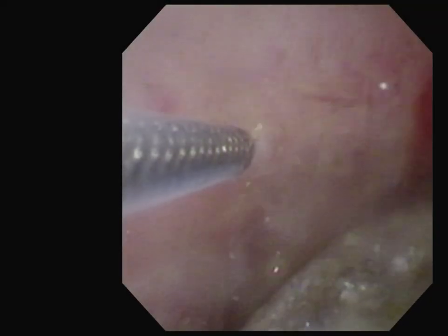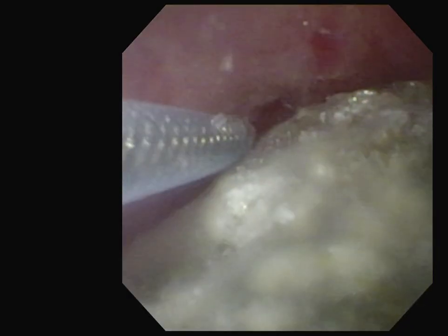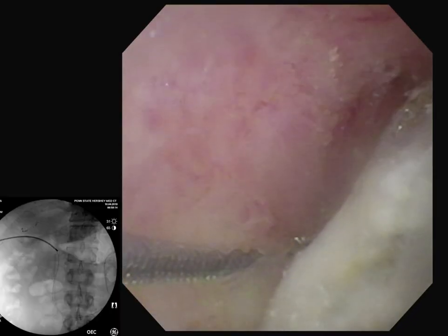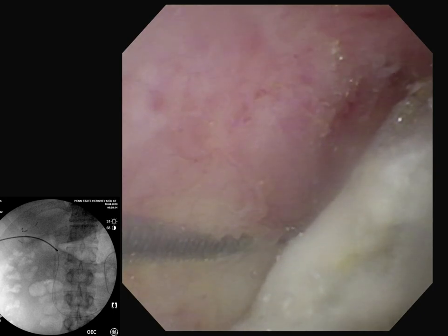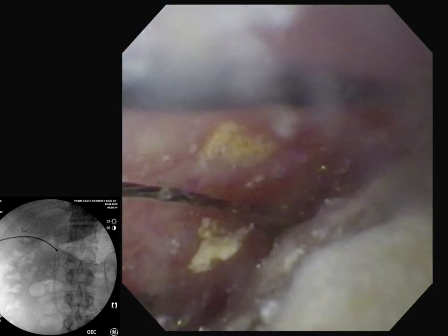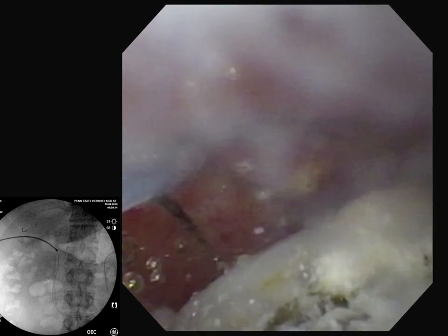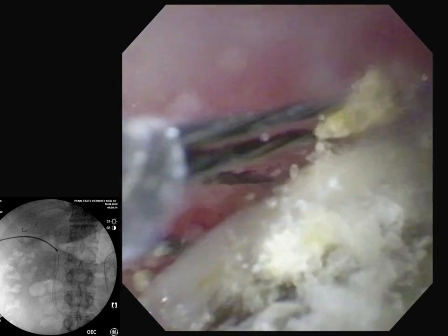The ureteroscope was brought to the level of the stone, and we attempted to use a biliary basket to retrieve the stone; however, the stone was too large. We then attempted mechanical lithotripsy with a lithotriptor basket advanced through the drain tract parallel to the ureteroscope under fluoroscopic guidance. However, the remnant gallbladder was too small to permit the basket to be completely opened, rendering mechanical lithotripsy impossible.